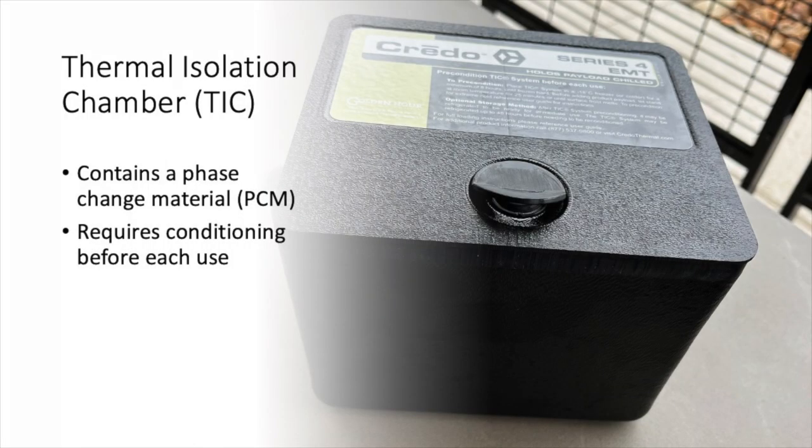The thermal isolation chamber, or the TIC. The TIC is a hard plastic container that contains a phase change material. The TIC requires conditioning before each use.